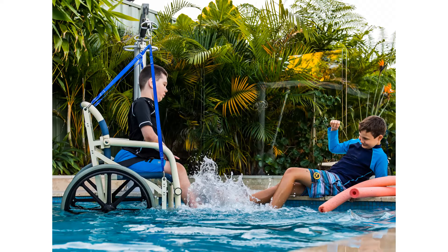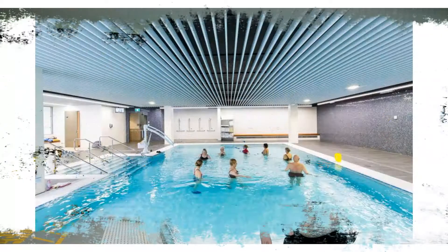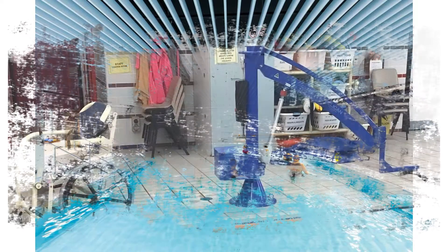Living with a disability is tough enough without the additional challenges due to inaccessibility. Wheelchair consumers or even someone needing assistance should not be restricted by a lack of access to enjoy the benefits of aquatic activities. It's simply not fair if you can't get into a swimming pool, and in some cases the Disability Discrimination Act makes it against the law for public places to be inaccessible. The answer is the use of assistive technology like our Pelican twin-arm pool hoist.